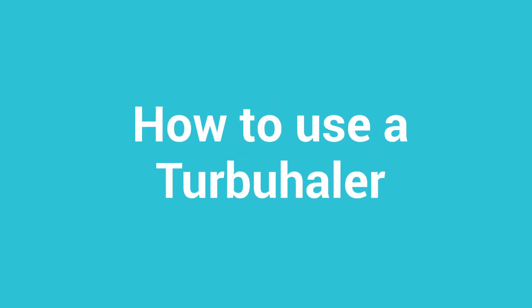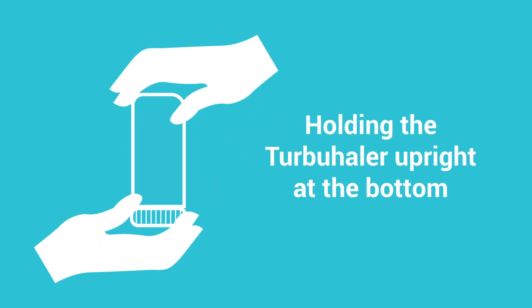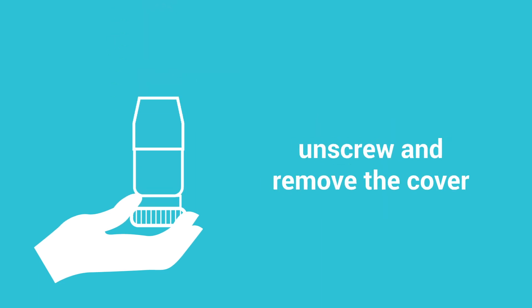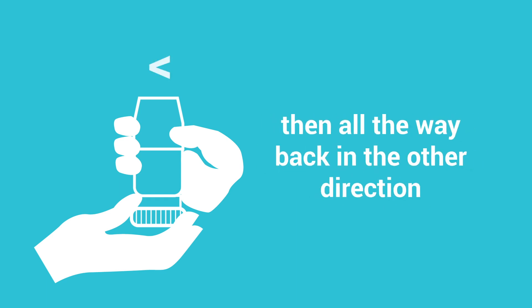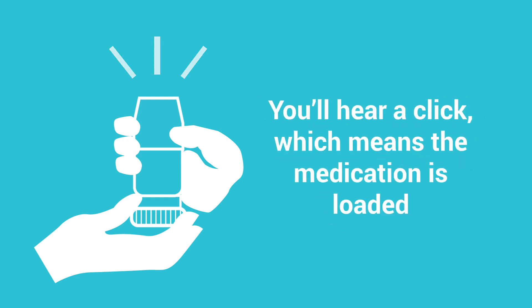Here are the steps for using the Turbuhaler. Holding the Turbuhaler upright at the bottom, unscrew and remove the cover. Turn the grip all the way in one direction then all the way back in the other direction. You will hear a click during this step, which means the medication is loaded.